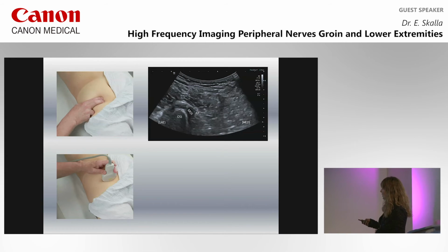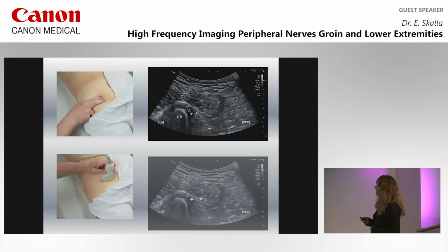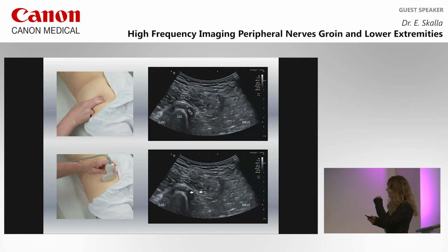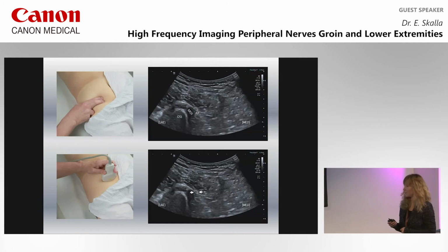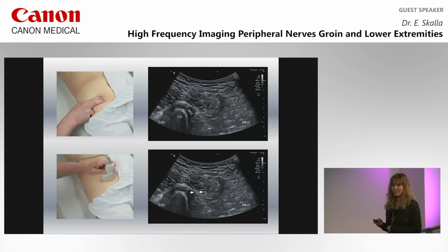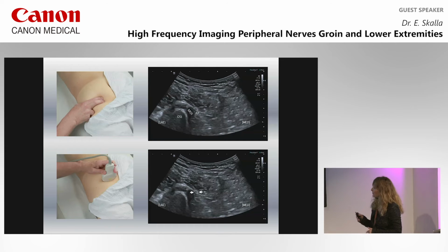You can use the Doppler, or you see an artery in this region, and proximal, superficial from the dorsal aspect, superficial to this artery is the pudendal nerve. Very easy to find and very easy to infiltrate here. I didn't believe Hannes until he showed it to me, so it's really a good thing.